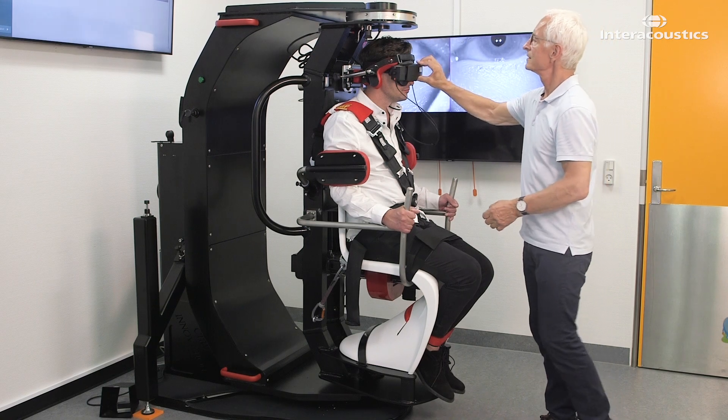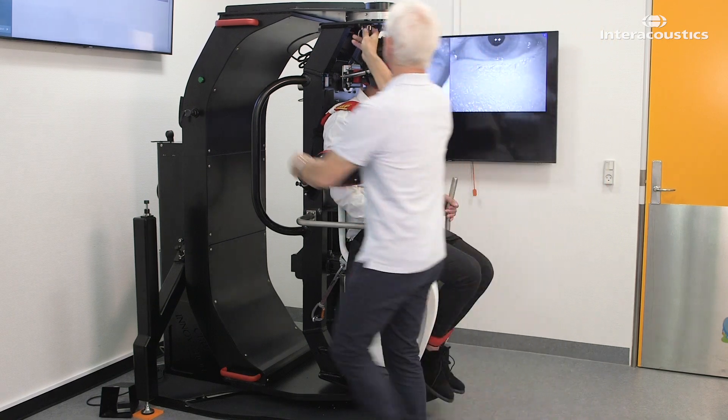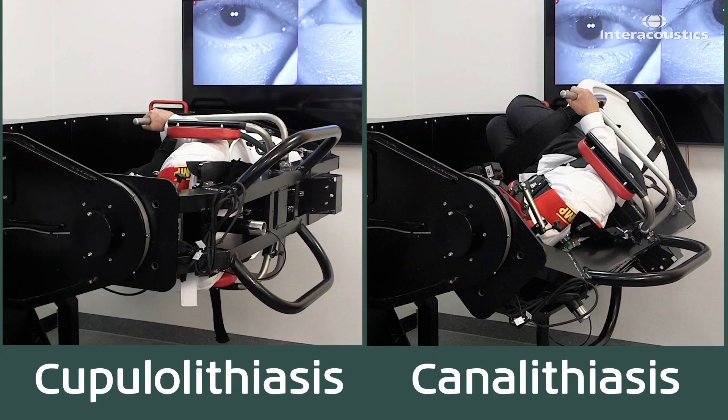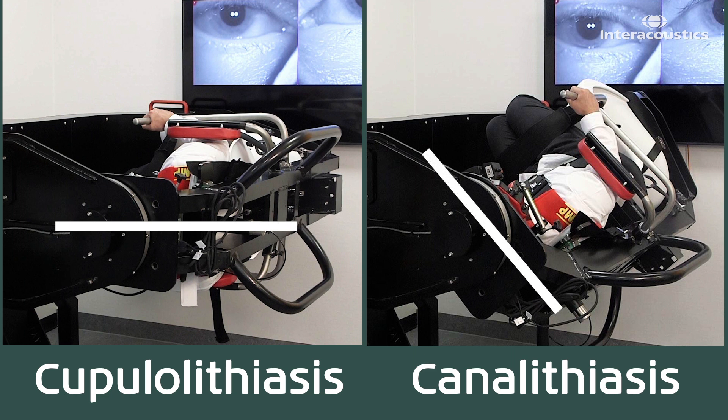This is how you treat lateral canal cupulolithiasis and canalithiasis in the TRV chair. The starting position for these two treatments differs by 45 degrees. Otherwise, the process and the end position is the same.